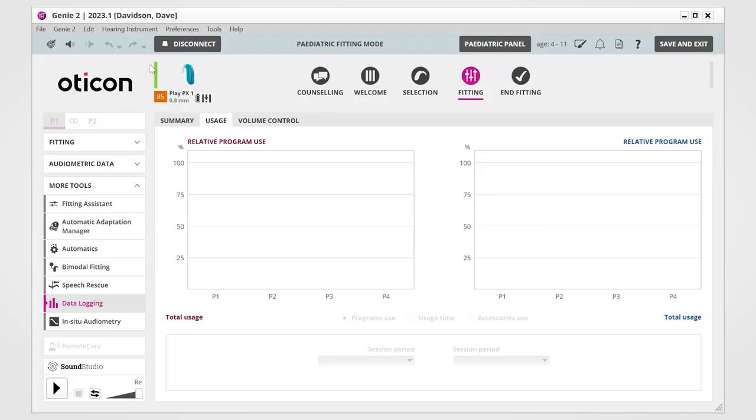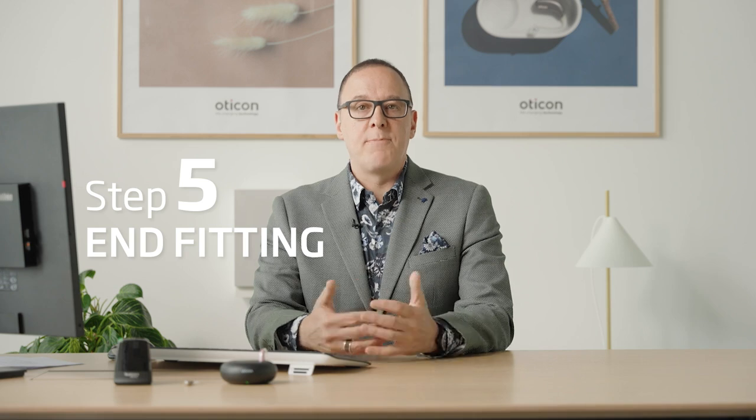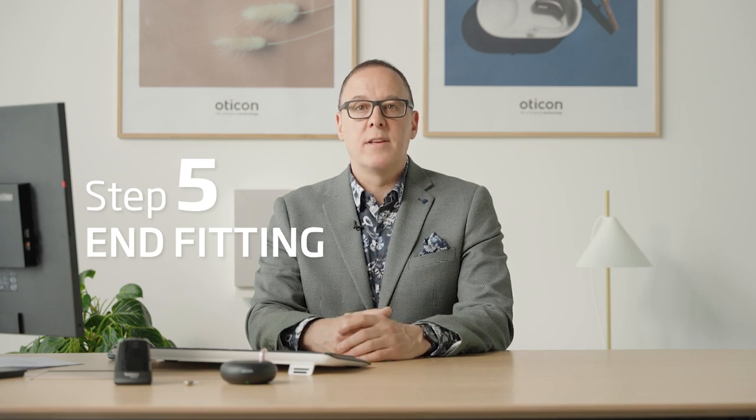The final thing to draw your attention to on the fitting screen is at the very top, where we have a green status bar. This green status bar is giving us an indication, when it is lit up, that there is communication between the hearing aid and the NOAHlink wireless programming device. That concludes the fitting, and that brings us to our final step, step 5, which is end fitting.